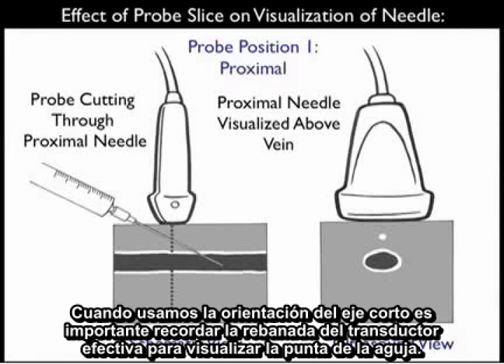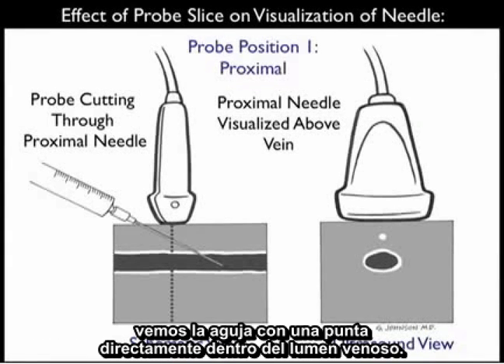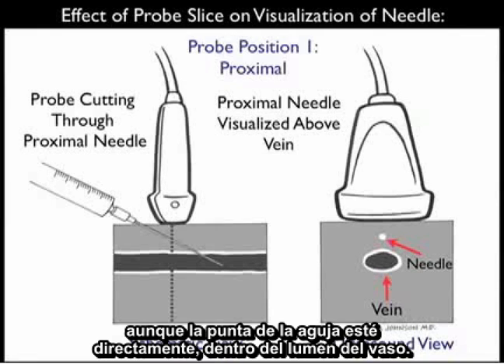When using the short axis orientation, it's important to remember the effect of probe slice on visualization of the needle tip. Here we see the probe positioned proximally along the needle shaft. In the schematic view towards the left, we see the needle tip squarely inside the venous lumen. However, because the ultrasound probe is positioned more proximally along the shaft of the needle, on the ultrasound view to the right all we visualize is the needle above the vessel, even though the needle tip is squarely within the vessel lumen.